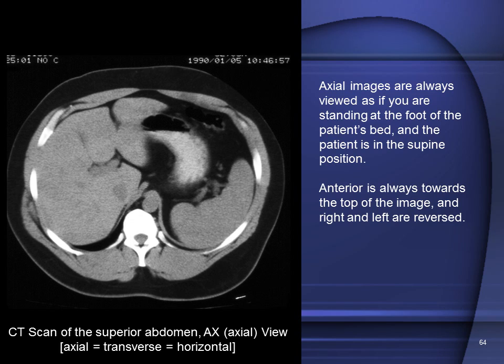The patient is oriented with reference to anatomical position on the film. So this is anterior, below is posterior, this is left, and this is right.